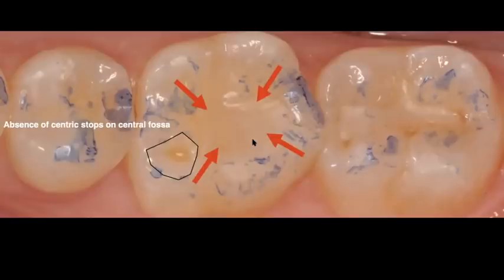And what I would recommend always is that before you go ahead and restore a tooth, if you have a large amalgam or an old or existing composite that is failing for whatever reason, grab some articulating paper. Have the patient tap on the articulating paper and look at where the occlusal marks are. And then design your preparation and visualize your restoration based on what you're seeing in that occlusal analysis.